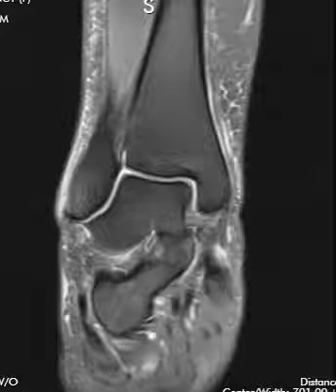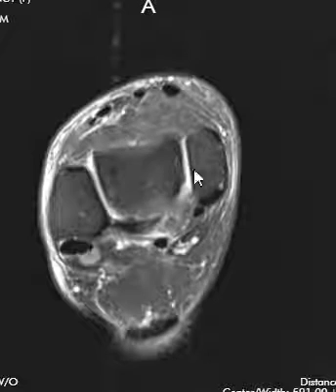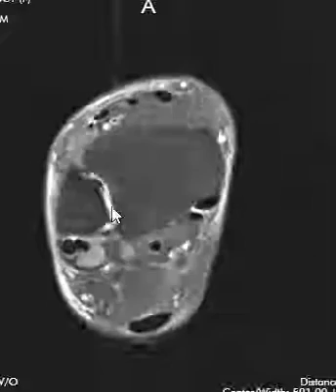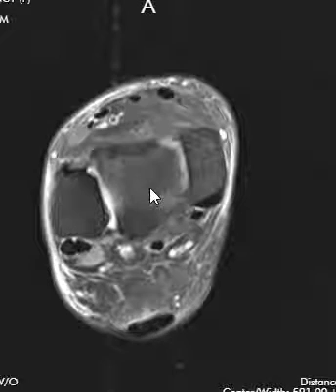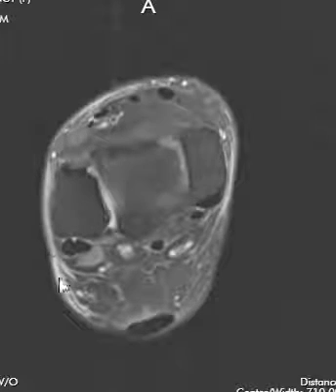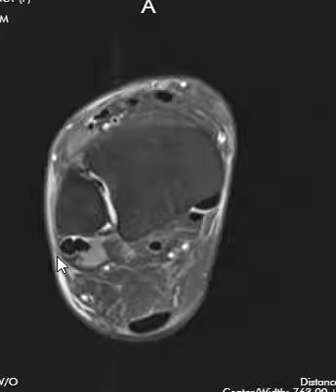Now we go on to the ligaments. There are ligaments all around the ankle — some on the medial side, several on the lateral side, and one big ligament complex on the medial side. We look at each one of these ligaments, which can be very hard to see sometimes, and check if there's a sprain or rupture. We also look at the subcutaneous soft tissues on the outside. This patient does have some bright signal beneath the skin, which can be related to injury or inflammation.